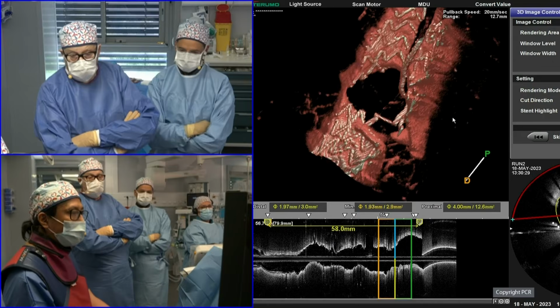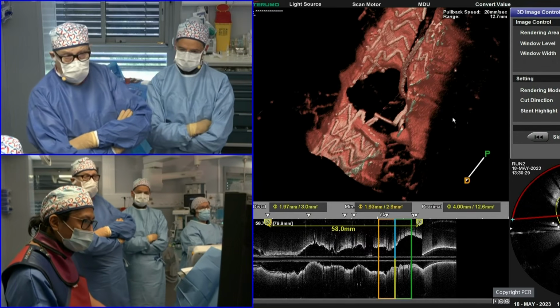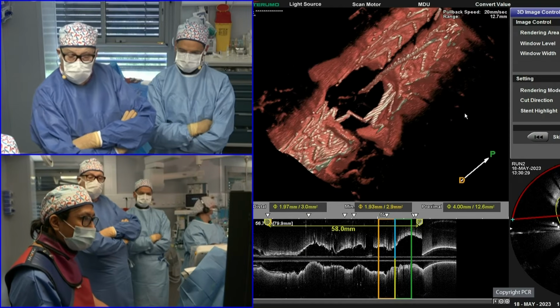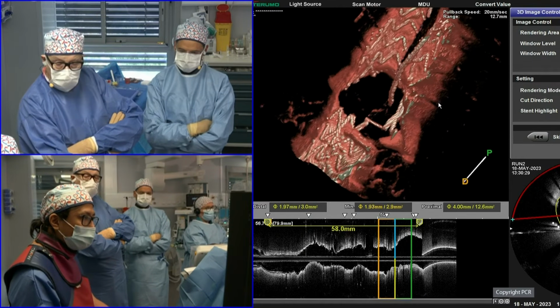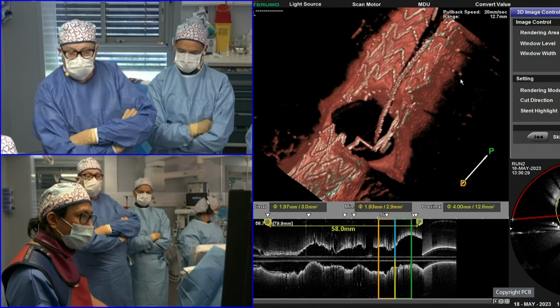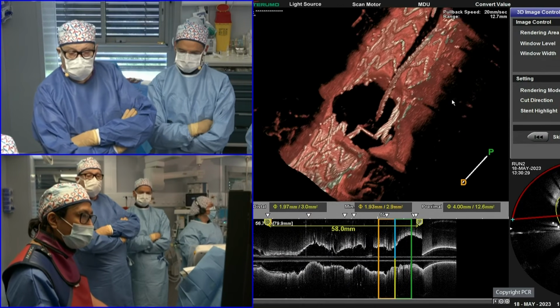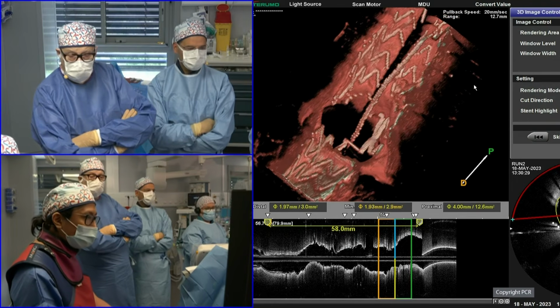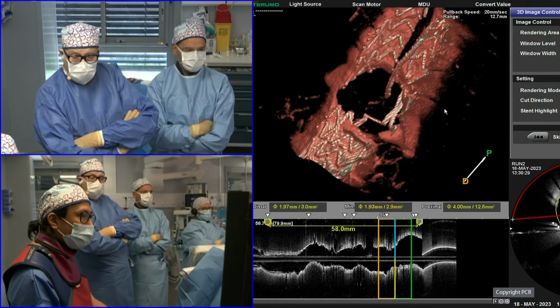Yoshi, could you just rotate it again, just slightly? Because with your interpretation, or Professor Kinoshita's, there was a link across. Had we done that OFDI prior, we'd have shifted the linker that was across the side branch to the right-hand side. And I wonder then also, once we've had that answer, Jens, whether this helps you in terms of satisfying that issue with actually slippage.